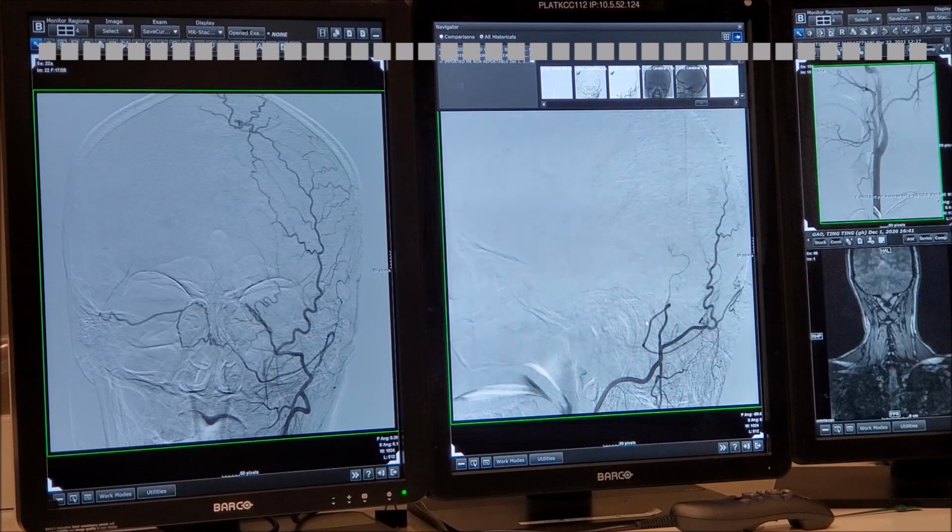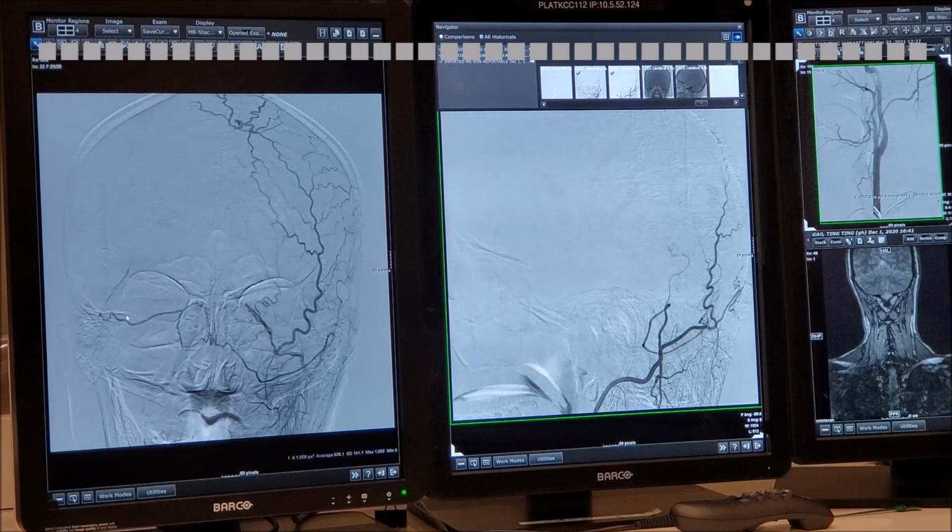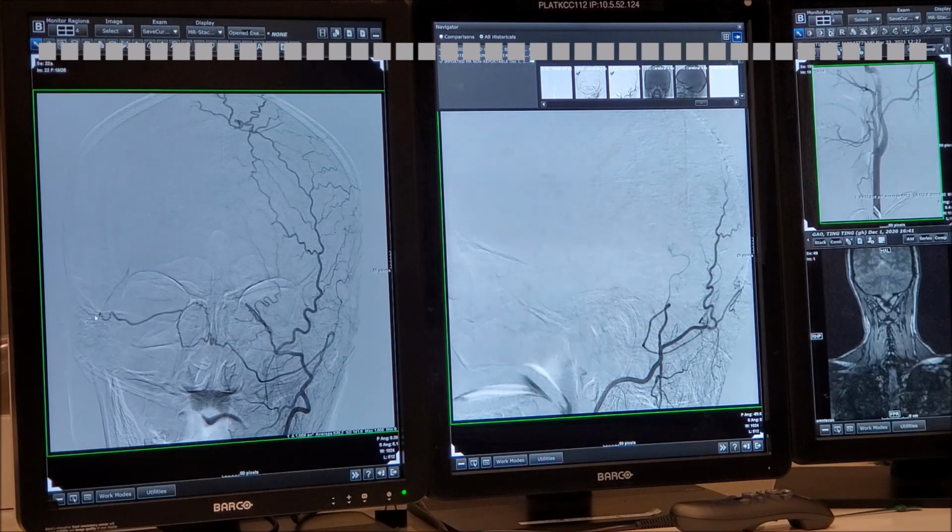So I trace it back, right? It had to go into a foramen. Foramen spinosum gives you a sharp curve. Foramen ovale gives you a sharp curve. I don't know the name of this, but this is a cutaneous branch that gives a bony artery here. You see it here. It goes in through some type of bony foramen, and this is what we were missing to reconstruct that dural fistula. This will supply the dural fistula.